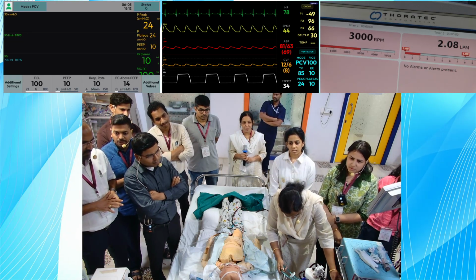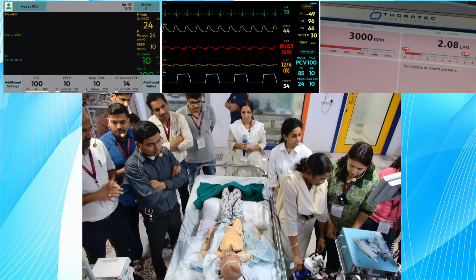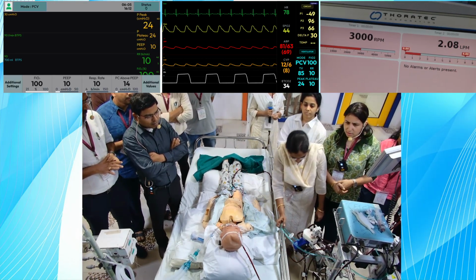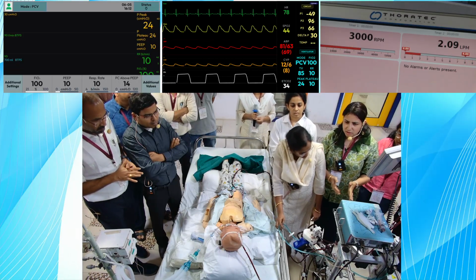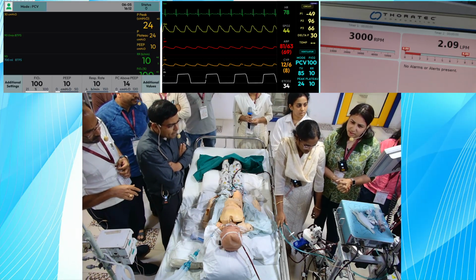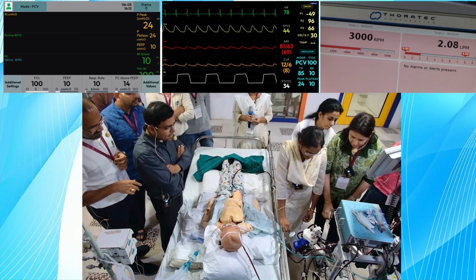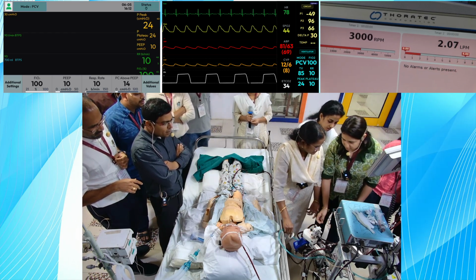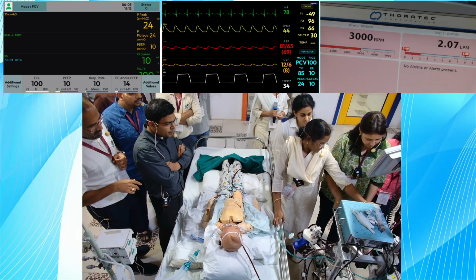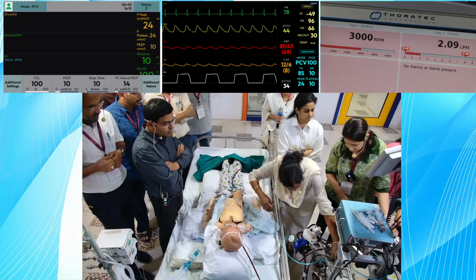First it comes. The sweep gas we have also changed. This connection has been there for many days. It is not reconnected. It has been running for the last 5 days, right? Yeah, so the connection should be fine. If you have doubt, you can change the connectivity. It probably got disconnected. You have to check the connection from there, then that would have come as a drop in saturation. Connected, na? Yes, sir.